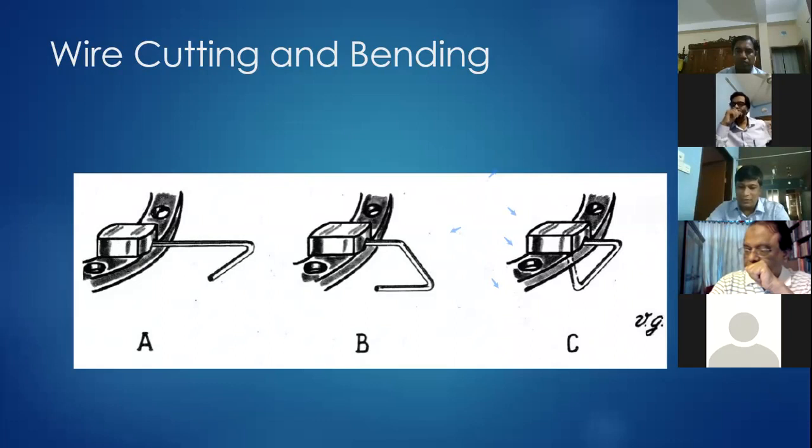Both ends of the wire, approximately 5 to 6 centimeters, must be left free for future tensioning, and both ends are bent into loops wrapped around the ring, and their tips should be kept on the underside of the ring so that it can't harm the patient or the physician.